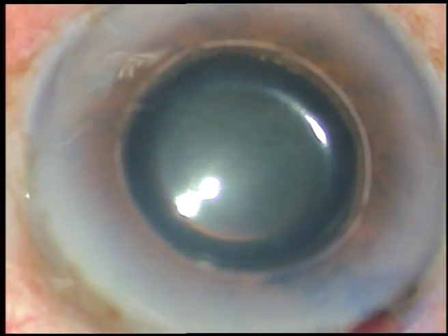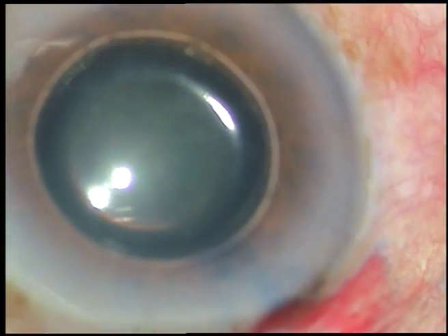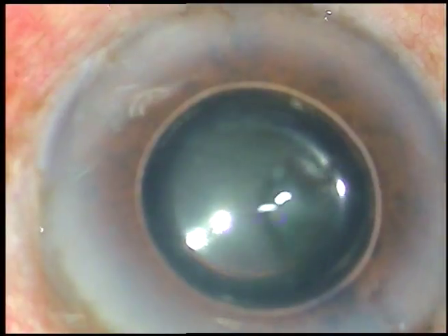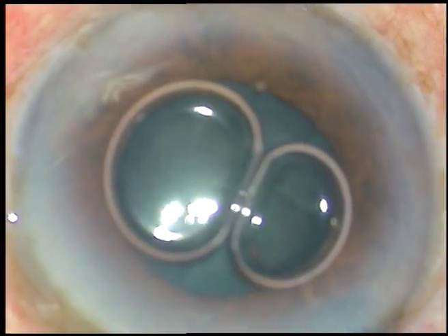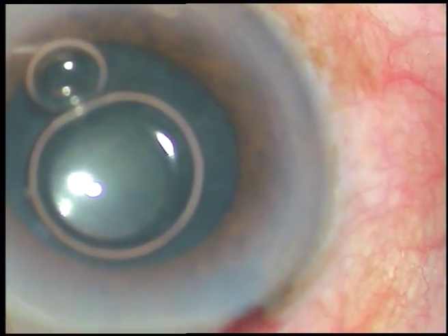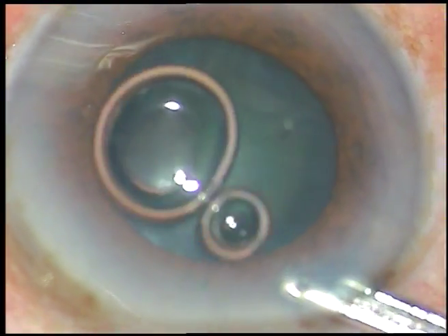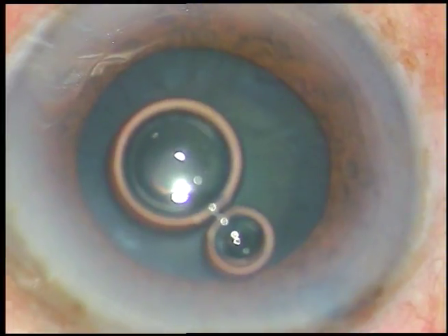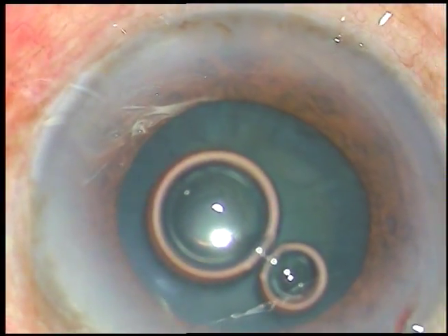The main incision has been made. Now the capsule is being stained with trypan blue dye. This is adrenaline — I want to see if the pupil dilates a little bit, which will facilitate doing capsulorhexis. The pupil didn't dilate much, but there was slight dilation. The pupil became about 5 mm after injecting adrenaline, and this will help a lot in capsulorhexis.